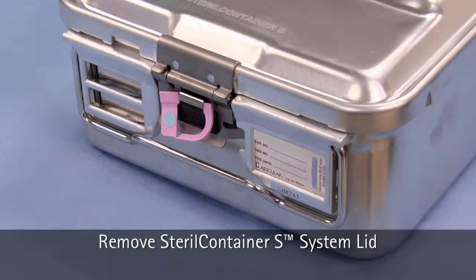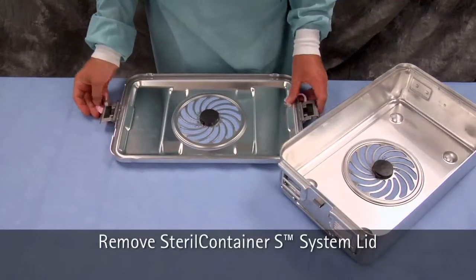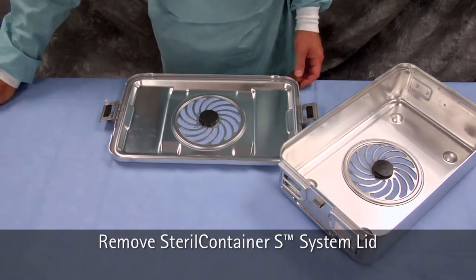Next, open the latches, which will break the tamper-proof locks. Remove the lid in one single step, making sure the container bottom is not contaminated.